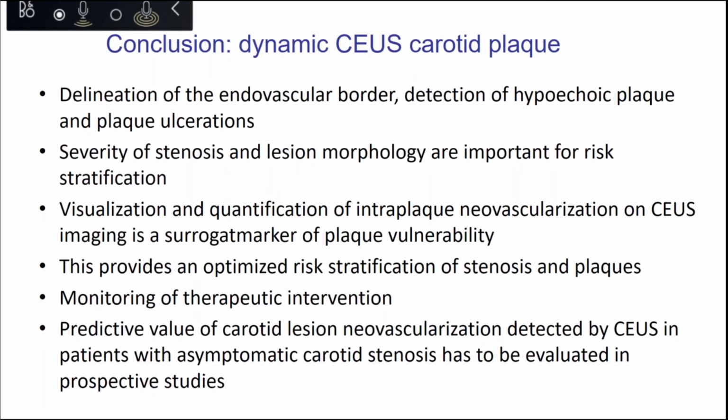Therefore, we can use contrast enhanced ultrasound to visualize and quantify intraplaque neovascularization as a surrogate marker of plaque vulnerability to optimize risk stratification of stenosis and plaques. And maybe we can also monitor therapeutic intervention.